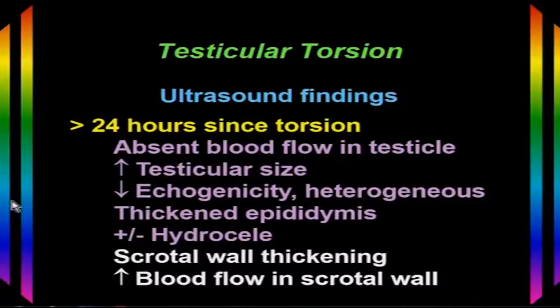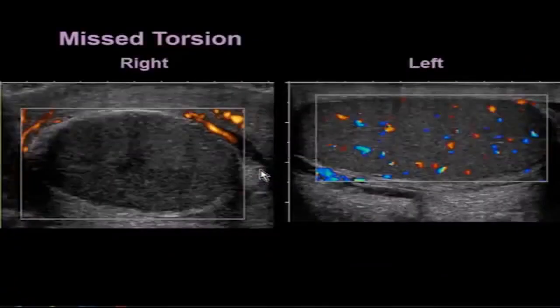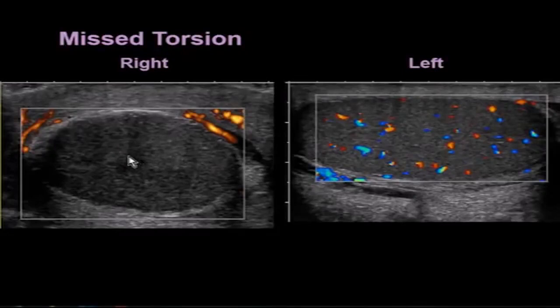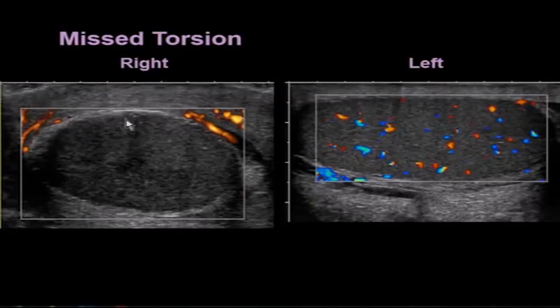Here's a patient with missed torsion. Notice the normal left testicle with a thin scrotal wall. The right testicle is hypoechoic and heterogeneous, with marked thickening of the scrotal wall and increased blood flow in the scrotal wall, but no blood flow inside the testicle itself.